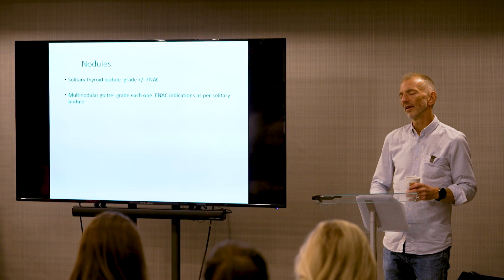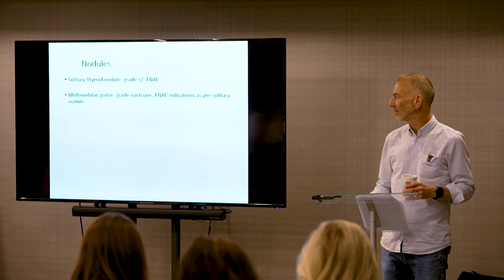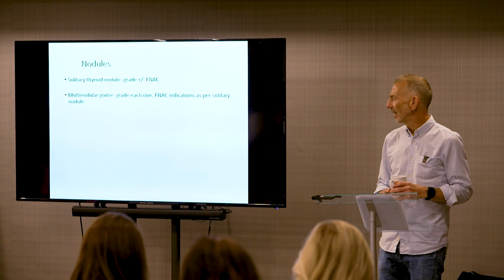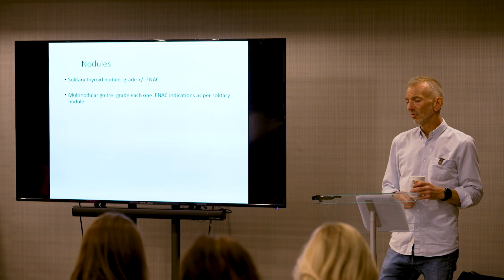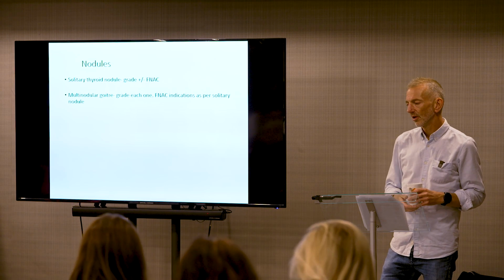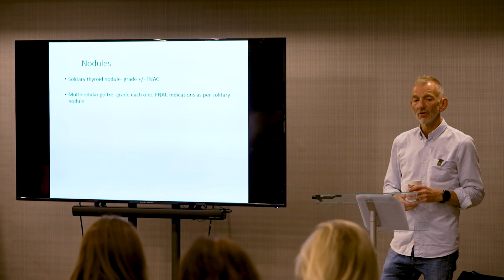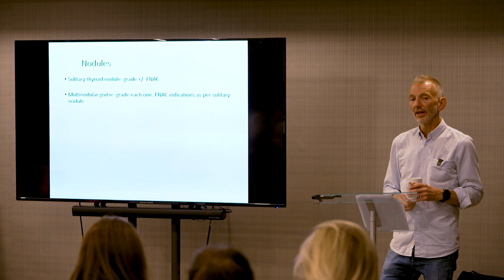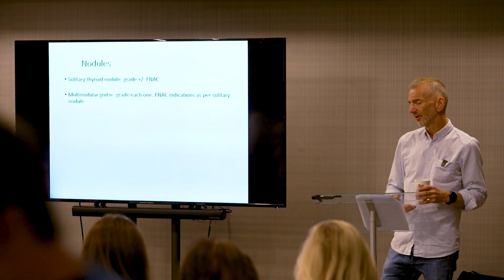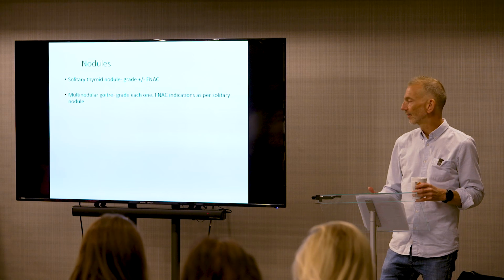But common sense applies, and in reality, most people who have multiple thyroid nodules do so because they're all multiple colloid nodules, so they're all benign. But in that situation, you want to check that all of the nodules that are recognisable, above a size of say 4 or 5 millimeters plus, do look generally benign, and pick out any, if applicable, that don't look benign or look a little bit odd or a little bit dominant. And that's not because they're necessarily bigger than the others, but they may look different from the others because they have a different ultrasound grade.